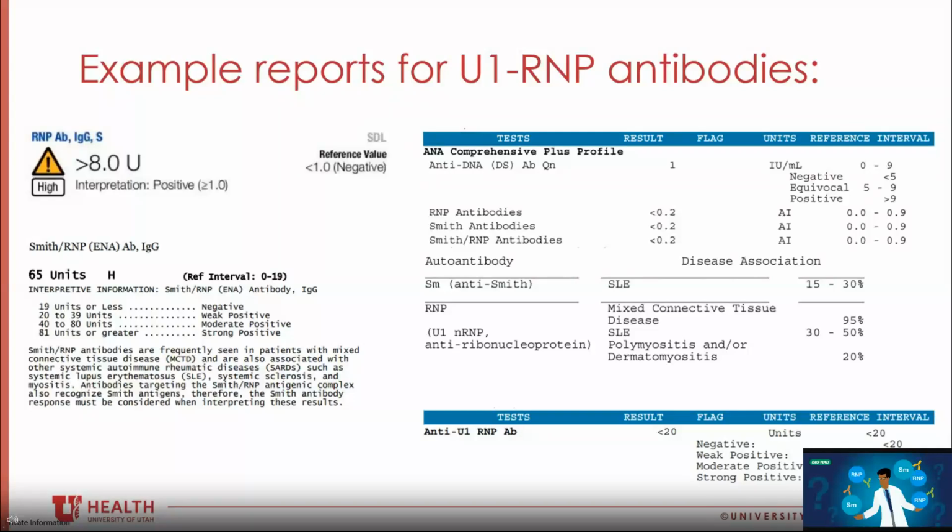However, the number and specificity of the U1 RNP specific proteins or peptides included is not consistently present in the name of the assays. In addition, there may still be manufacturers or laboratories that use the intact complex, which also contains Smith proteins, but label the assay RNP. Lack of consensus between the results of these assays is not rare, and all the reasons for this non-consensus are still unclear.